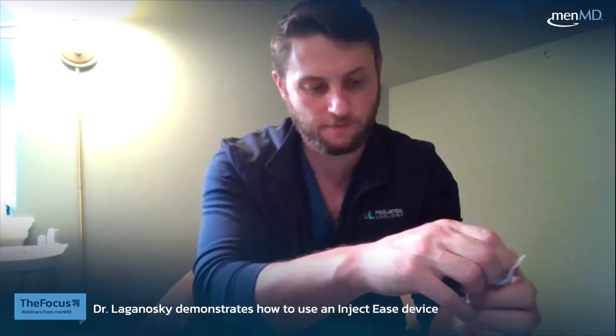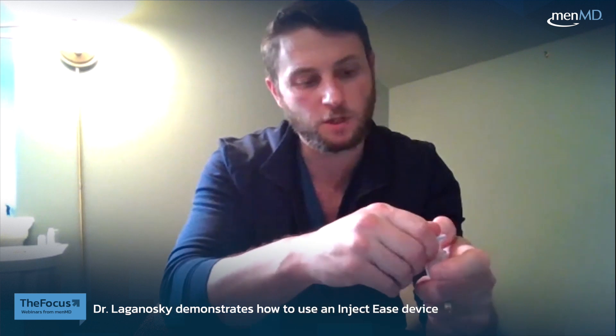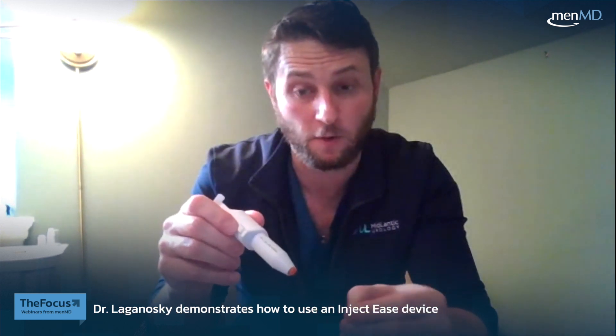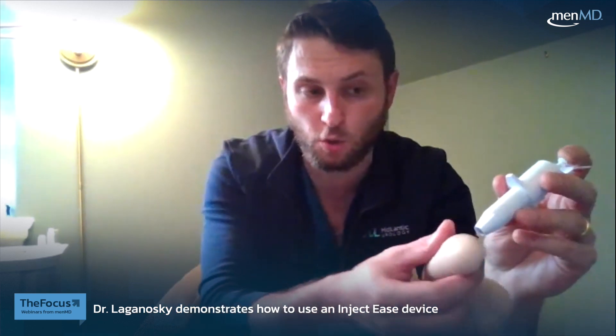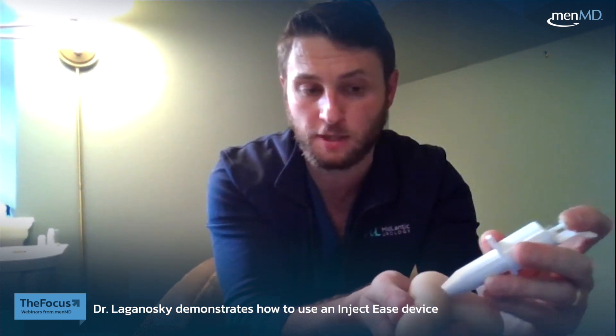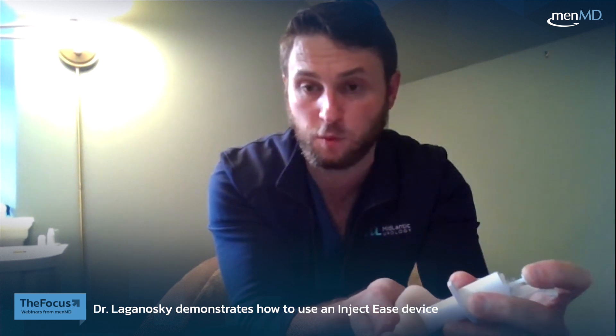We push in the device and uncap the needle tip. Once uncapped, the needle comes out of the tip of the device and we're ready to apply it to the penile tissue. We push it in at the desired spot and in one fell swoop employ the needle.